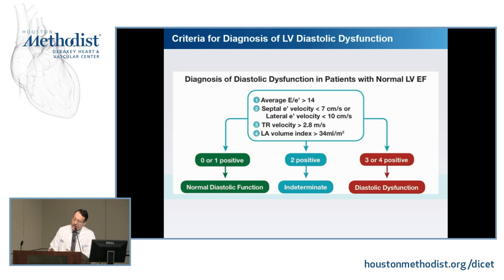The problem with the age-specific cutoffs is if you try to group a number of studies together and then do some sort of meta-analysis through these, and then come up with the values, this way, you end up with wide confidence limits. So the consensus of the writing group was this alone by itself should not be used to define an abnormal function. How about then other variables?